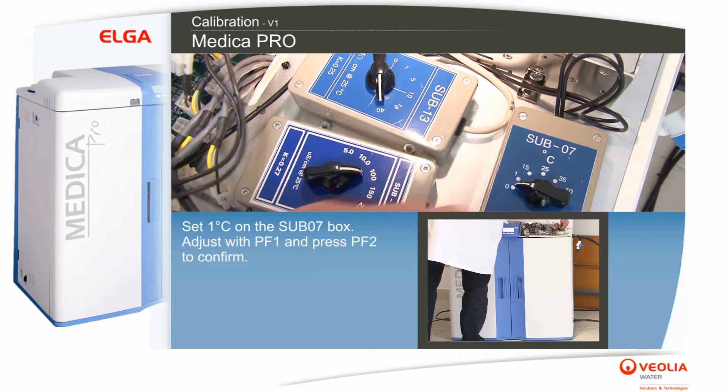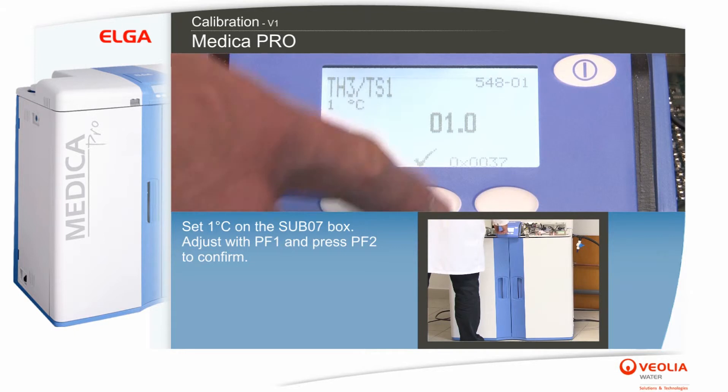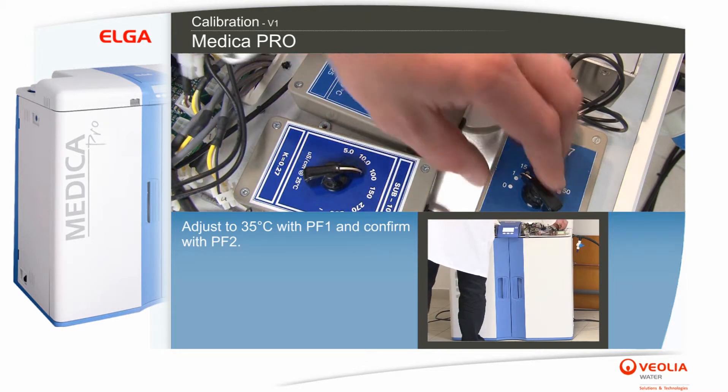Set 1 degree on the sub-07 box. Adjust with PF1 and press PF2 to confirm. Adjust to 35 degrees Celsius with PF1 and confirm with PF2.